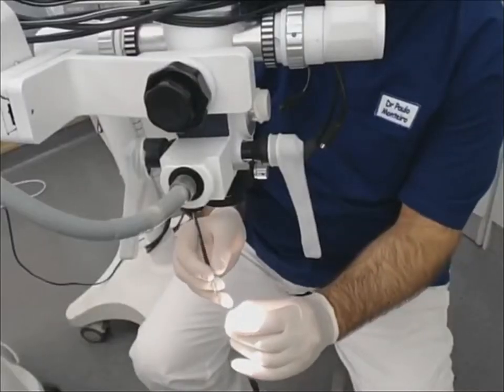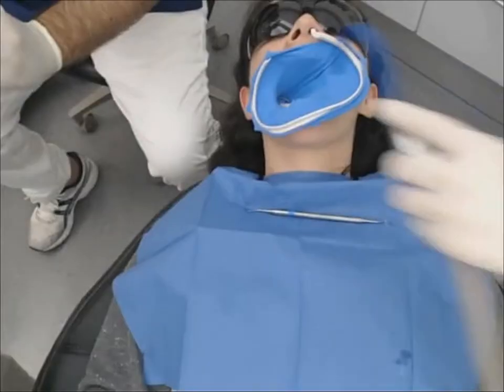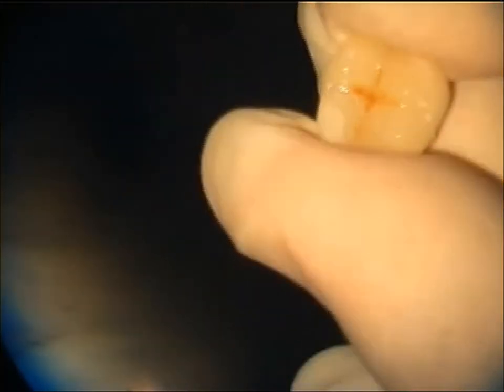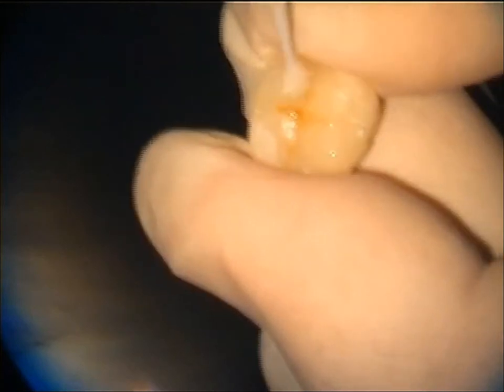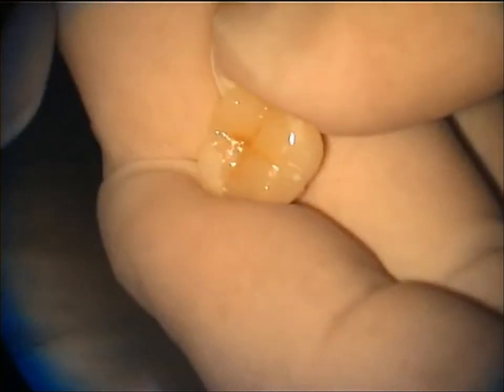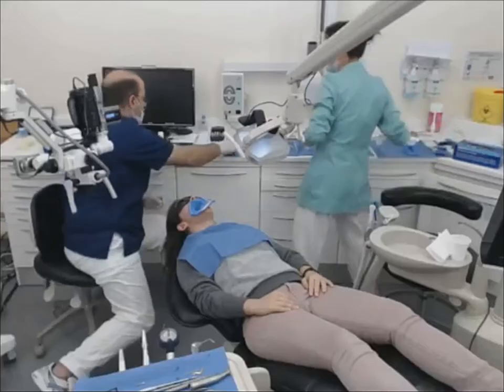Okay, so when you have a lot of tint, what I do is first apply it, but if it's too much, I pick some up with a clean micro brush. I just touch the surface, like you see, and remove some intensity. Okay? And it's too much, so it looks natural, like you see. In this case, you don't need too much tint, so I think it's enough. I'm not gonna apply more, so I just make the light cure now.